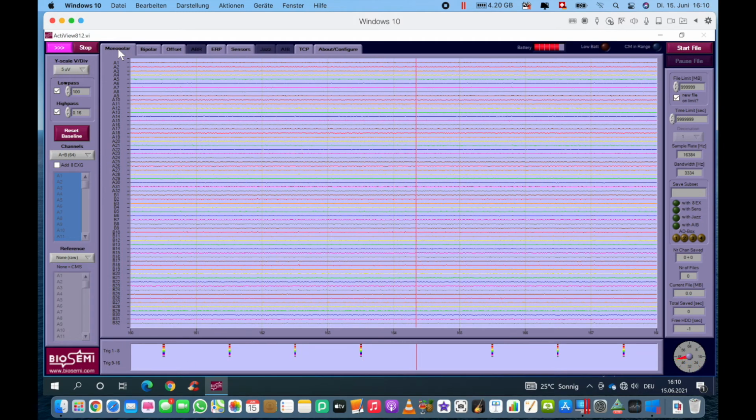So I'm going to let this run for about an hour. I will just come back with an update in about 50 minutes from now.